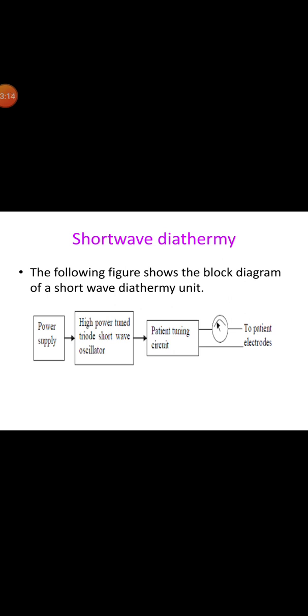When shortwave diathermy is applied in pulsed mode, the mechanical effects of the treatment are applied independent of thermally affecting the tissue. One of the most promising applications of pulsed mode is that it's able to facilitate increased flexibility and joint mobilization for restoration of joint range of motion. Shortwave diathermy includes non-thermal benefits as well, including acceleration of cell growth, enabling damaged cells to return to normal functions, and increased wound healing. Shortwave diathermy is also effective when used with other rehabilitative modalities.